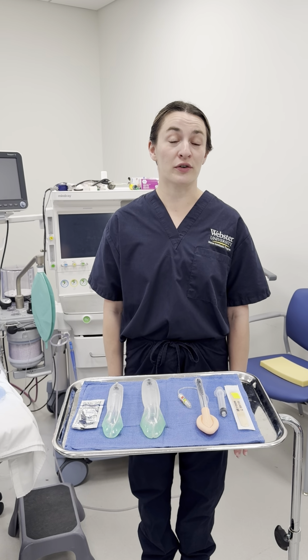A supraglottic airway is an airway device that is used when encountering or anticipating a difficult airway. These devices are used very early on in the ASA and DAS difficult airway guidelines. So let's talk about them, how to use them, when not to use them, and then I'll show you how to use them on a patient, okay?